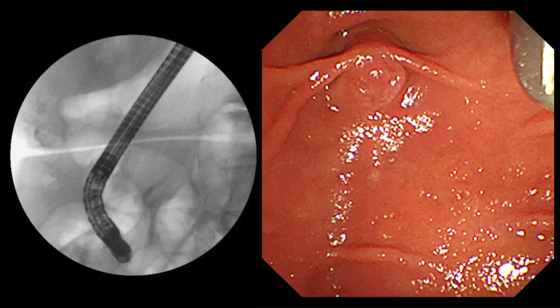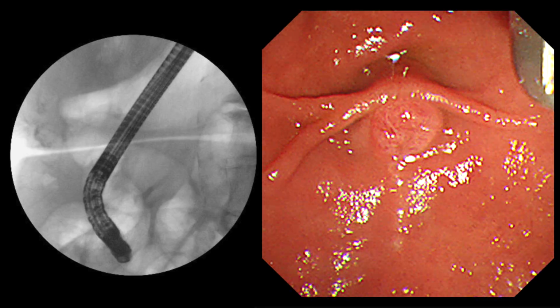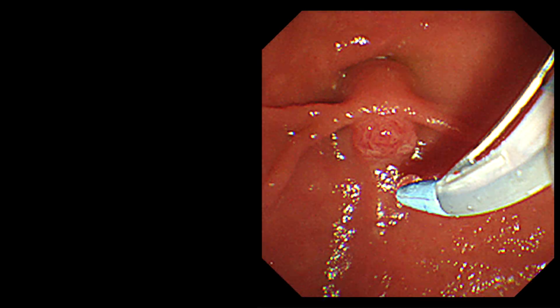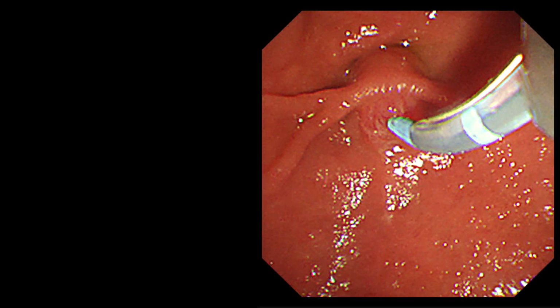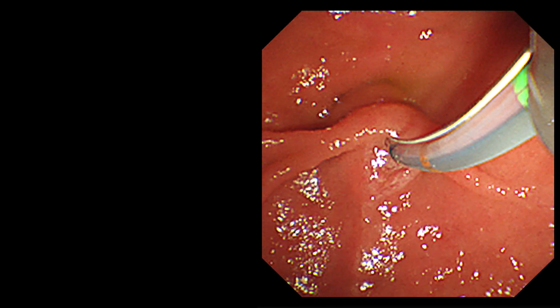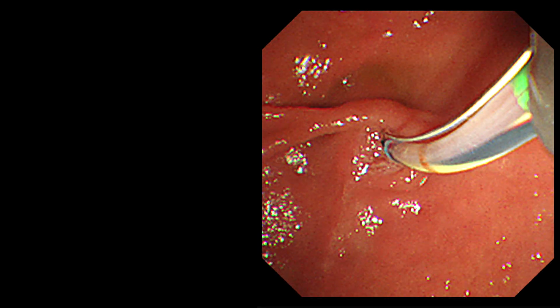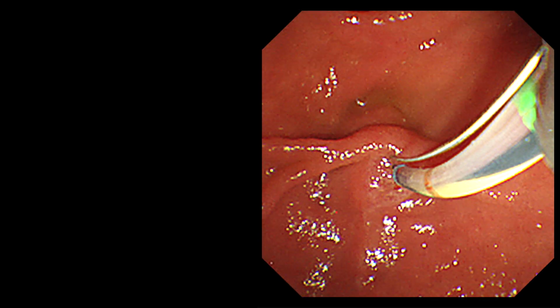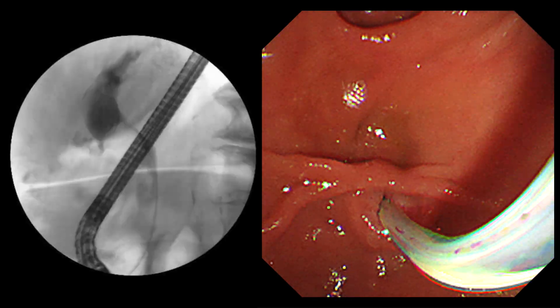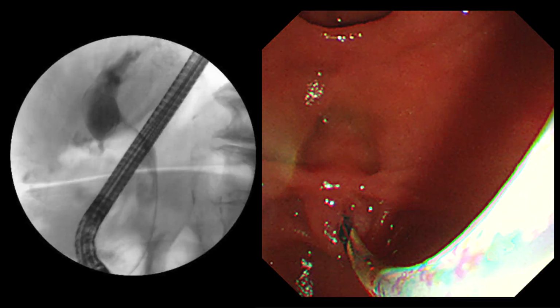The patient now attends for an ERCP and cholangioscopy. The procedure is being done under conscious sedation using midazolam and fentanyl. As you can see, the papilla looks normal. Biliary cannulation was fairly straightforward. The initial cholangiogram shows the large mid-bile duct stone and several smaller stones below it.